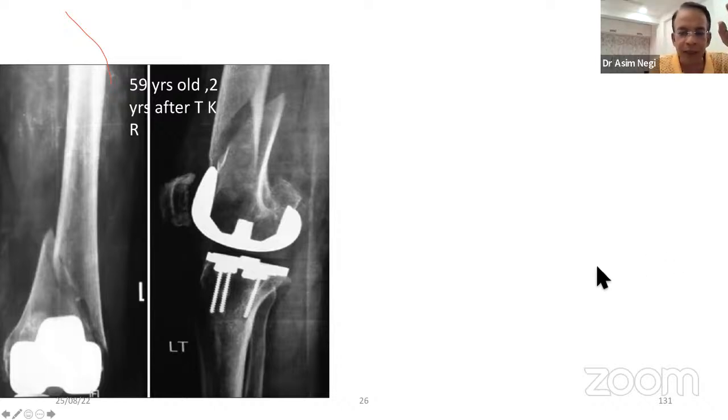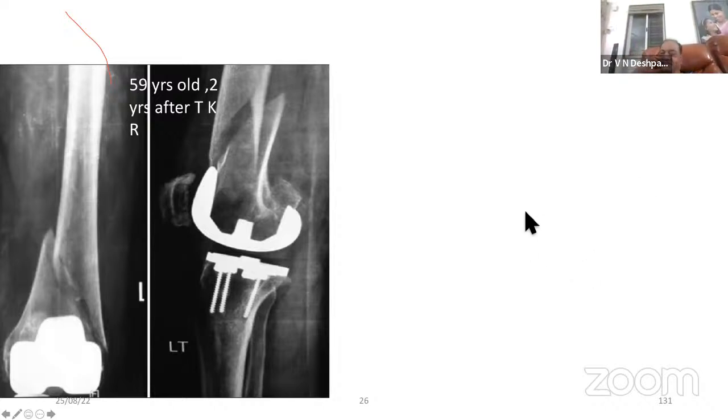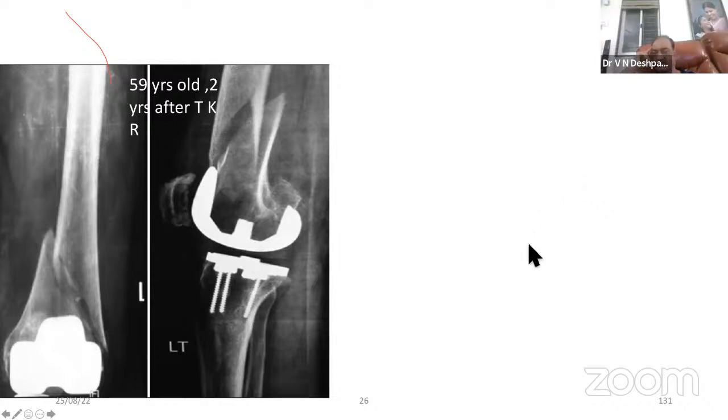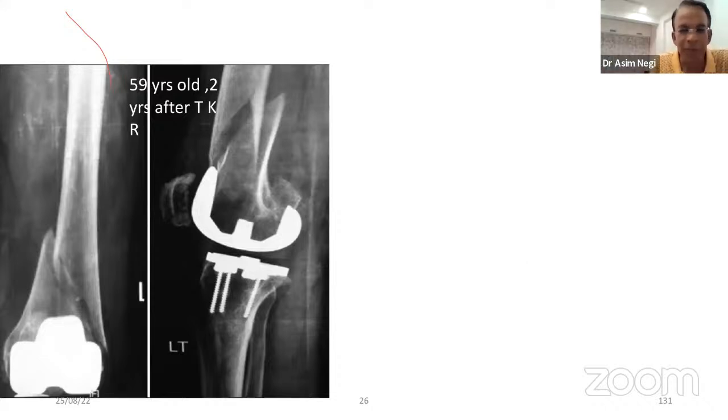I want to add something. Yes, sir. Send a whole series of intra-operative pictures and the immediate and follow-up pictures, around 65, osteoporotic, very low fracture. Very rarely will I do a double plating primarily. So I have done double plating intra-articular, very low.